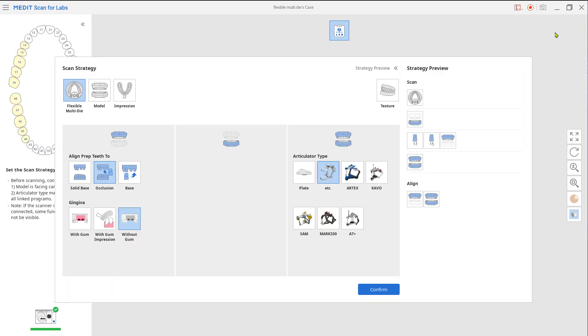Choose the flexible multi-die. Align prep teeth to base and gingiva option for maxilla and mandible if needed.